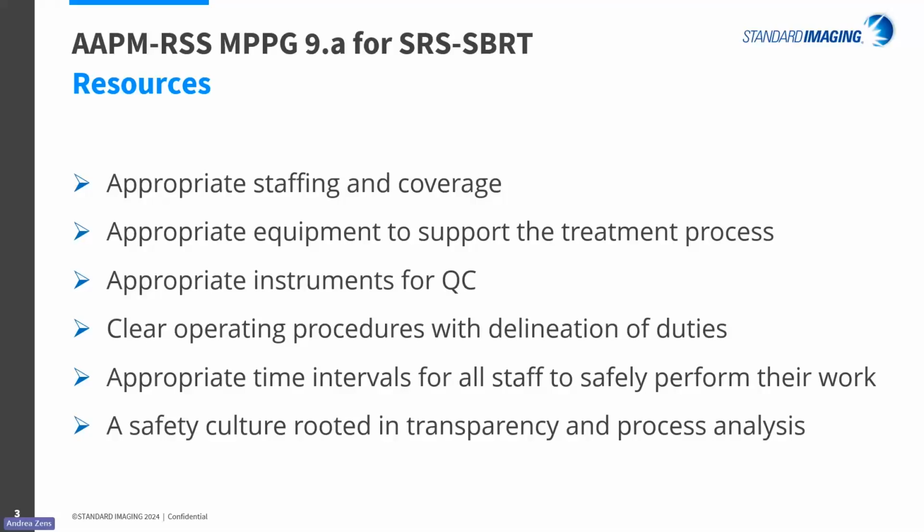As noted in this report, given the high dose per fraction and the critical importance of targeting accuracy, SRS SBRT services require a strong commitment by the radiation oncology program and the facility to provide appropriate resources. Both the clinical team and the institution's administration must understand their roles and commitments in this regard prior to implementing SRS and SBRT services. Resource commitments are vital to your stereotactic program to meet clinical goals while limiting risk and emphasizing patient care and safety.